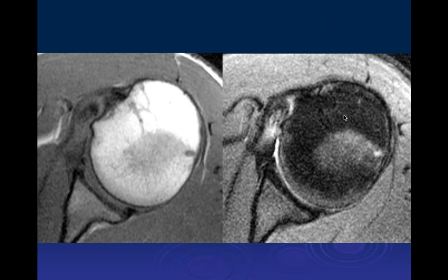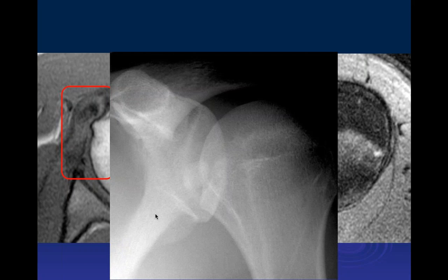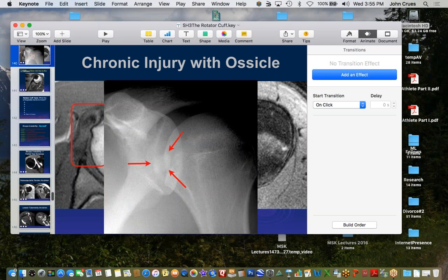A companion case on axial images shows signal abnormality of the subscapularis with a small rounded hypointense piece — this is also an avulsion of the insertion. We can even see it on radiograph. This is a chronic avulsive injury to the subscapularis.